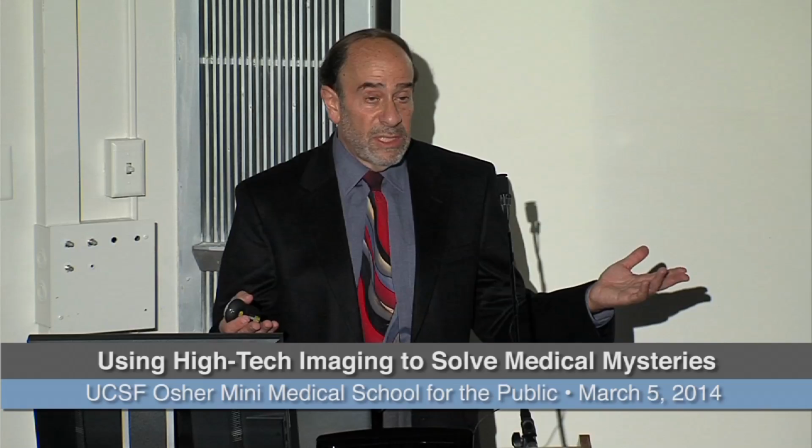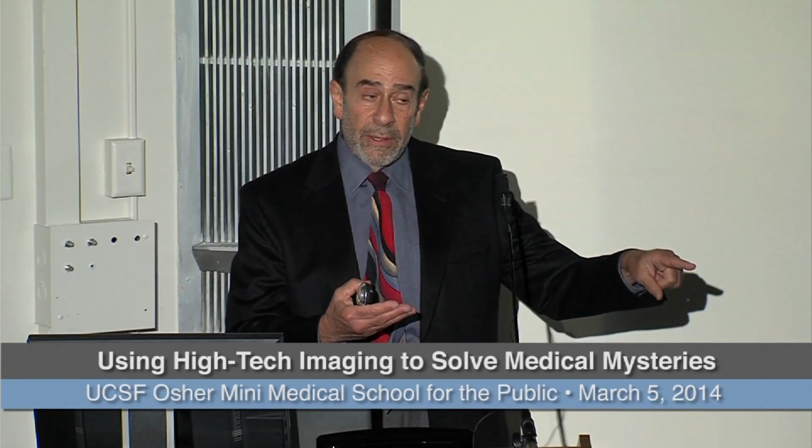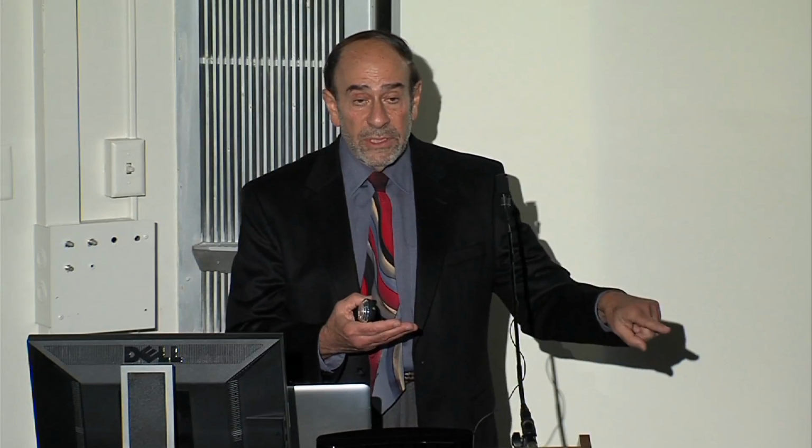And then we can also, of course, give you CDs. You can take them to some other institution. They can put it into their system and compare it to a study being done at their institution side by side, as if it was done in their institution, and vice versa. You can bring us CDs. So it's really a remarkable change.